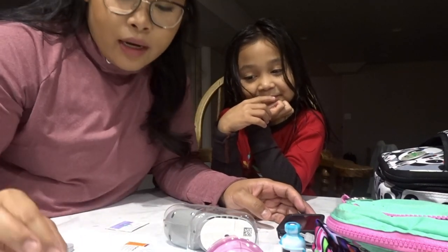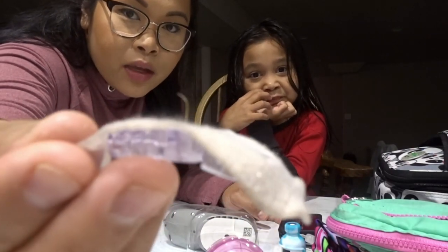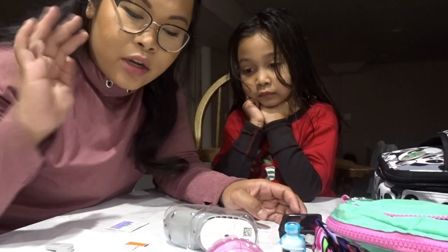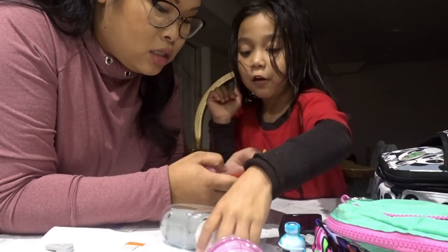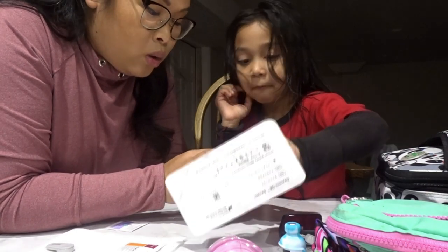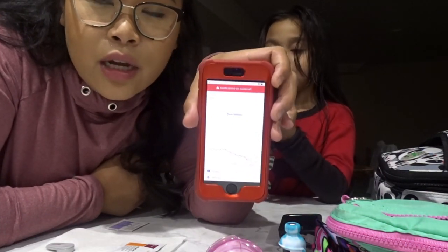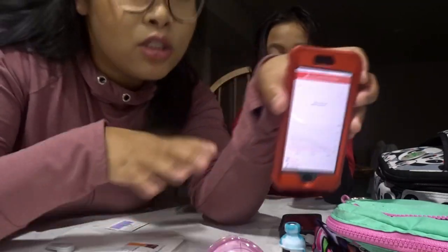I already took off the old one and this is what it looks like - the little wire that goes in her interstitial fluid to take her blood sugars. First thing you have to do is stop the sensor or enter the code. You have to stop the sensor or wait until the sensor expires. The code is 9-1-1-7.